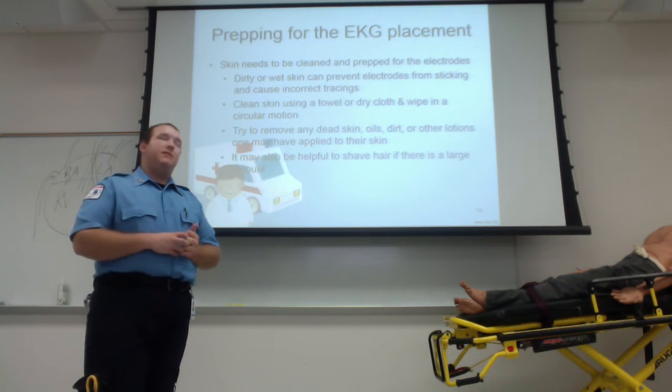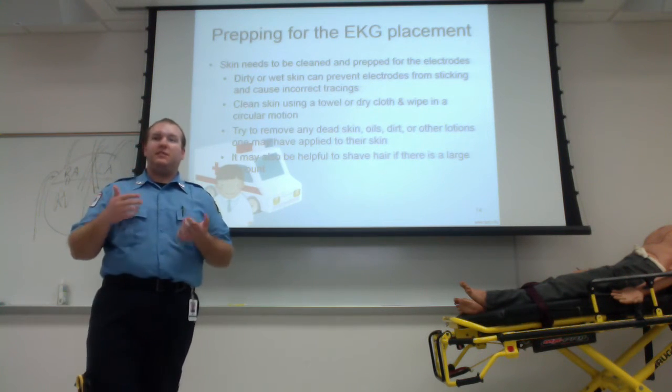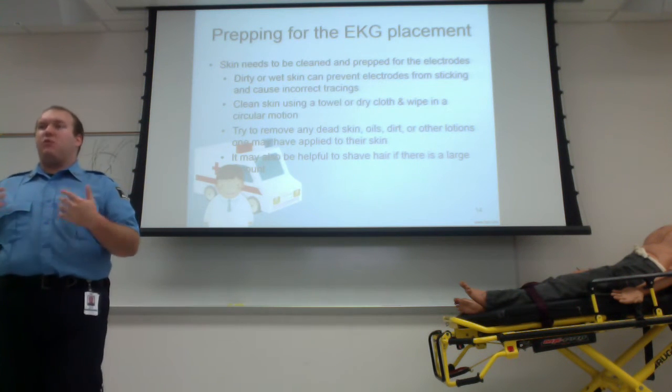You should take the time to truly prep the skin, because by taking those few extra seconds to truly prep the skin, you will in turn get a much better, cleaner, and more effective reading.